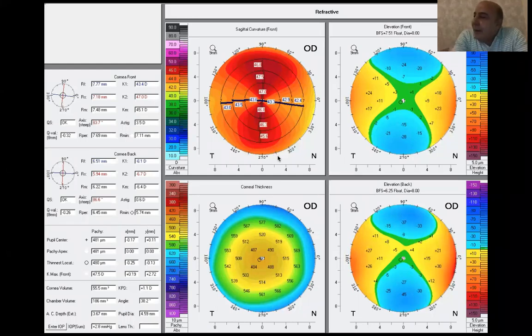And again, you may have haze in spite of using mitomycin. But in case of redo for PRK, you have to keep in mind to use a large optical zone, apply mitomycin, give the patient some vitamin C, and keep the patient on steroid for a longer time.